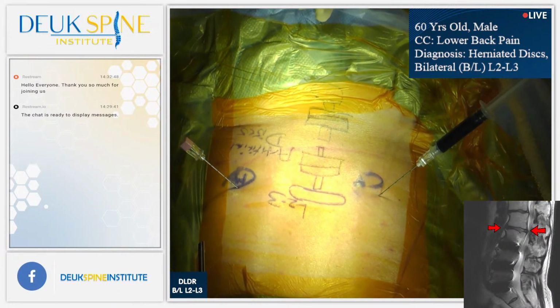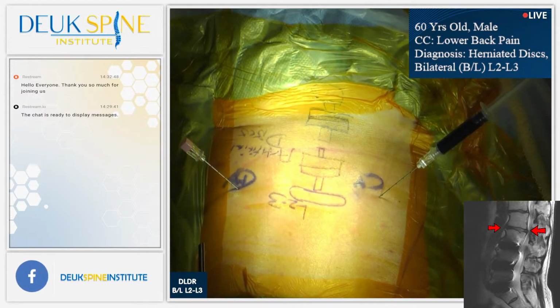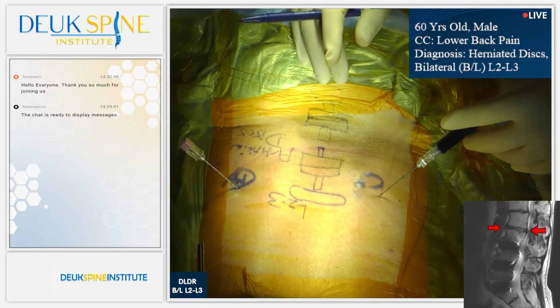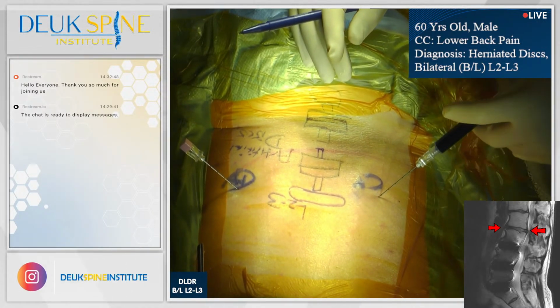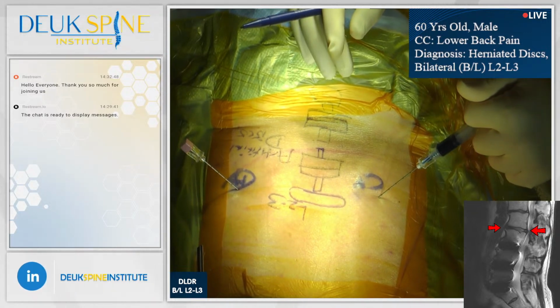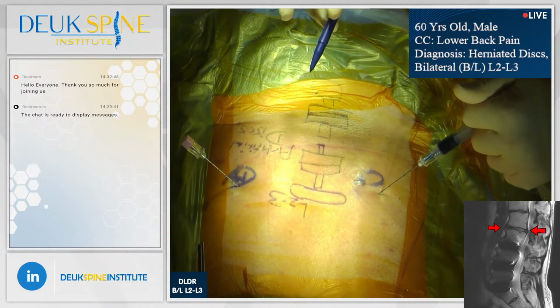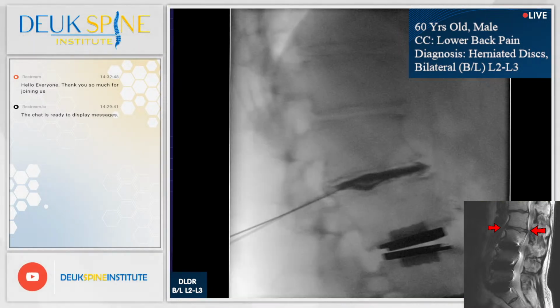All right. We're going to put you to sleep in just a minute, but I want you to keep your head still. Yeah, lay still, okay? Perfect. You're doing great. Everything's going perfect for you. This is the part where we wake you up for a minute, though, okay? How bad is that on a scale of 1 to 10? How bad does that get? How high does it go? What number?